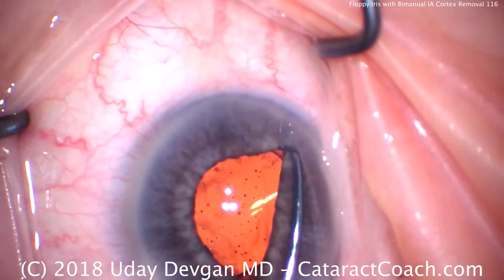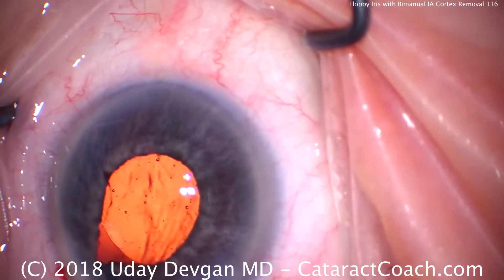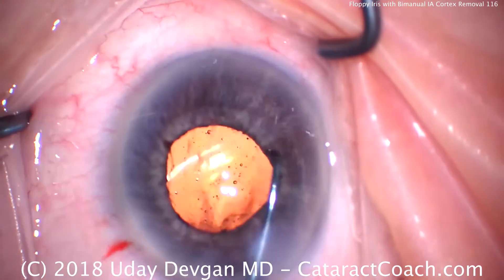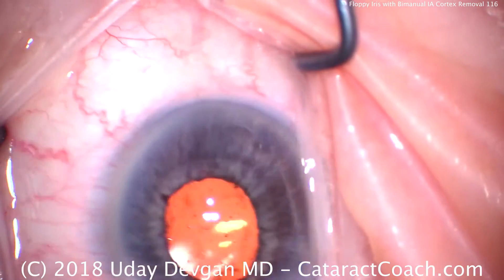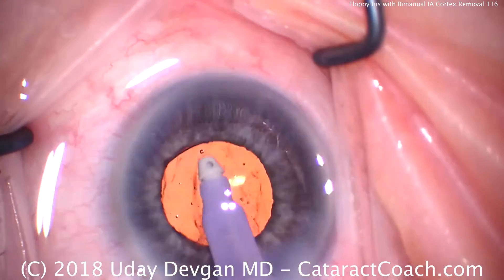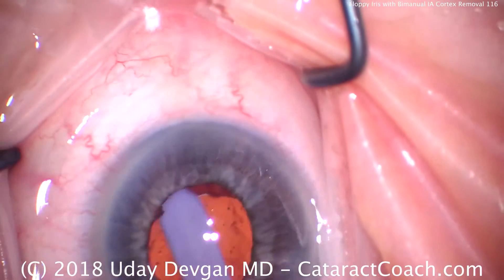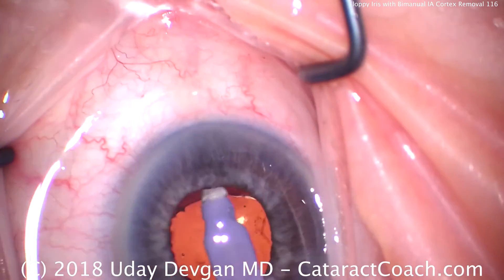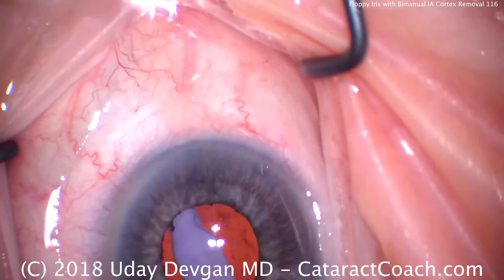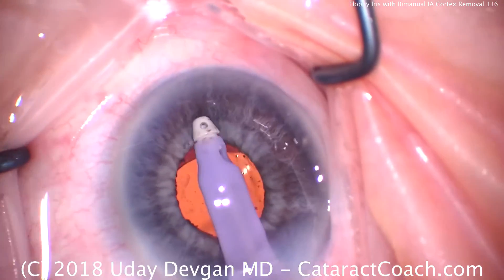We can examine — yes, there's definitely some cortex material in that nasal quadrant. Subincisional temporal, superior, inferior looks fine, but nasally, under the nasal iris, there's going to be some cortex that has to be removed. IA probe — let's get up under there and try to grab that cortex. Careful not to grab the iris too much. I think we pretty much have it, but how do we know for sure? Well, we have to check.